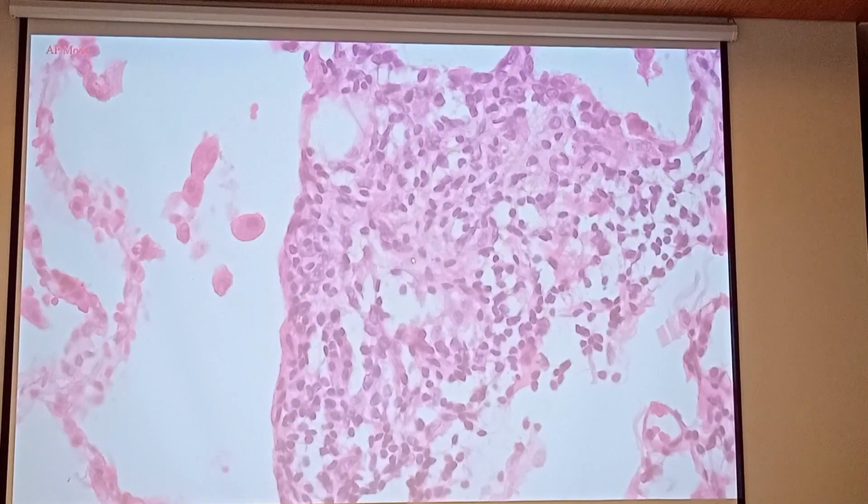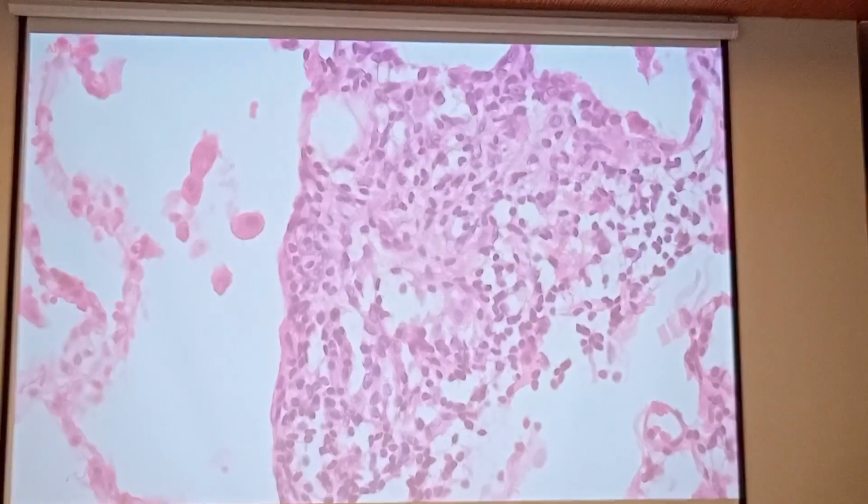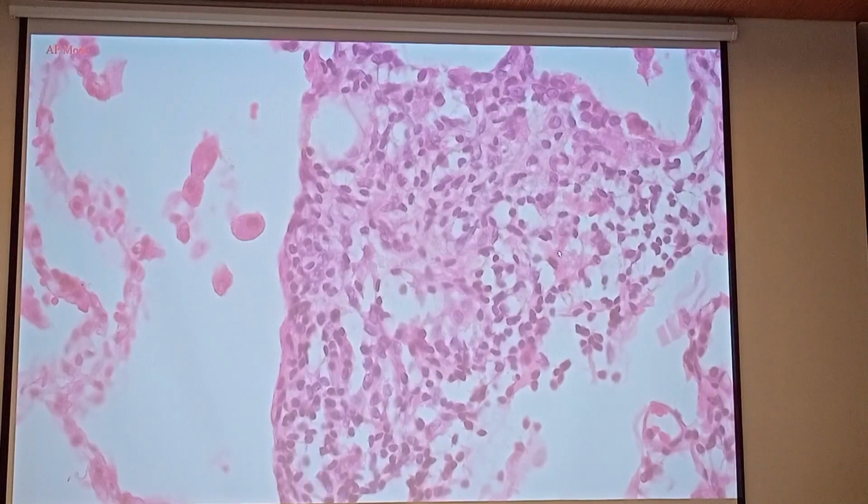Yan, mga macrophages na mga yan. And I suppose there are also smaller ones, like this, with blunt ends. These actually are your fibroblasts, which secrete a little bit of your collagen fibers that form part of your granuloma.